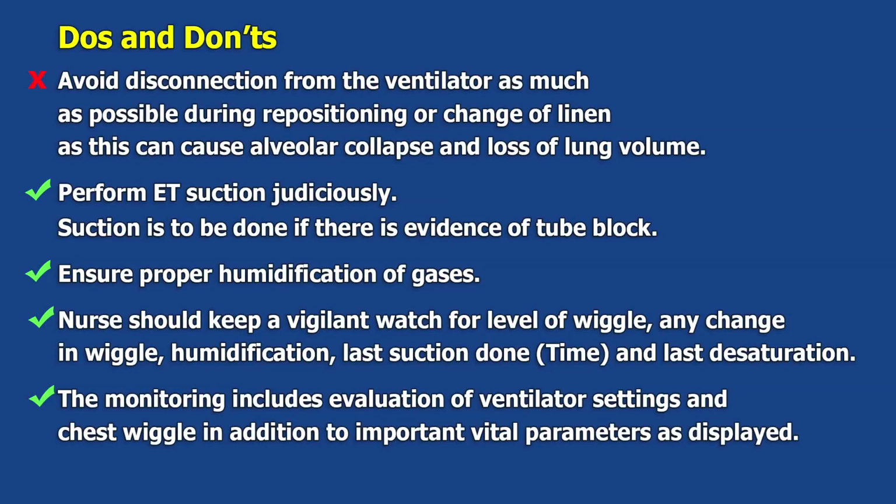The monitoring includes evaluation of ventilator settings and chest wiggle, in addition to important vital parameters as displayed.